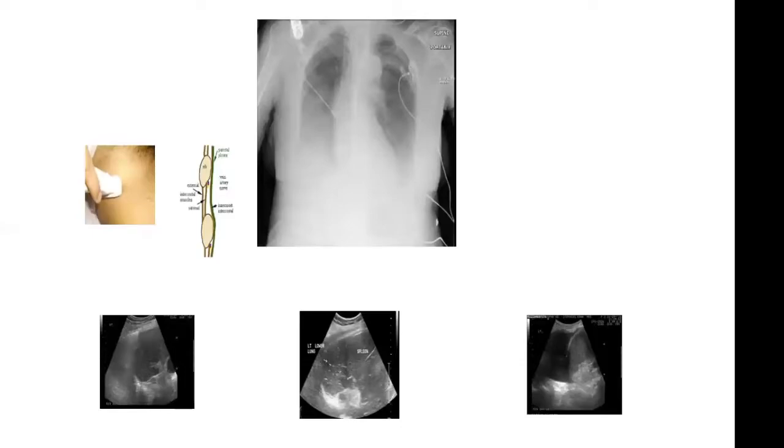So let's have a look at this examination of the chest. You can have a chest x-ray, particularly if you look here, we've got indistinct hemidiaphragms, lots of silhouette signs, there's a veil-like density. Ultrasound will tell you what is occurring at the bases. It can be normal lung, which is highly reflective. This is at the right lower lobe, but the lung is aerated. There's no image behind because sound is reflected by air in the normal lung.